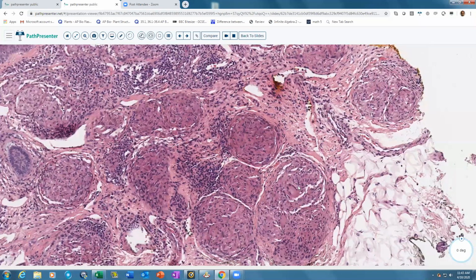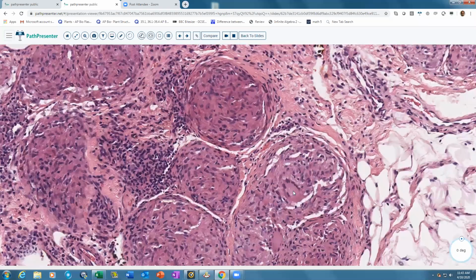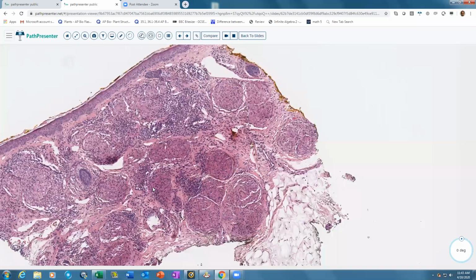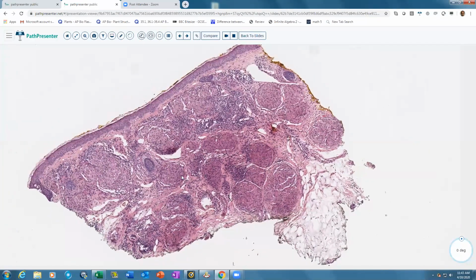So this collection of macrophages, some giant cells, you might see some asteroid bodies. And once you see this, you still have to do your stains to make sure it is not some sort of an infection process. So you do the AFB, the PAS, Fite, and once everything is ruled out, then sarcoidosis is a diagnosis of exclusion. So these are known as sarcoidal granulomatosis, and then compatible with the clinical impression of sarcoid once you have ruled out all the infectious processes.